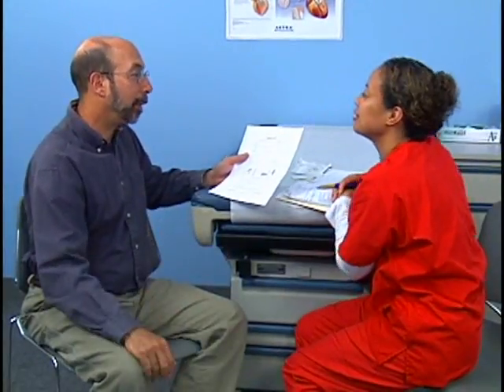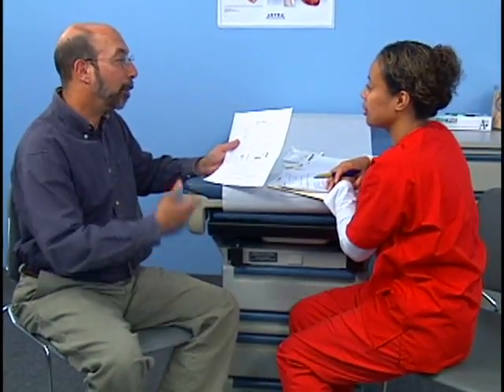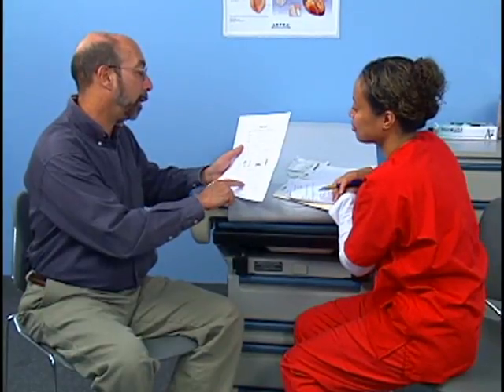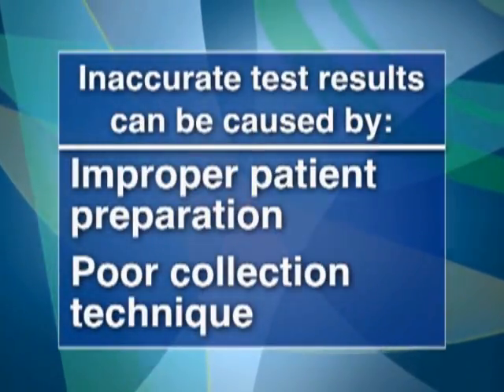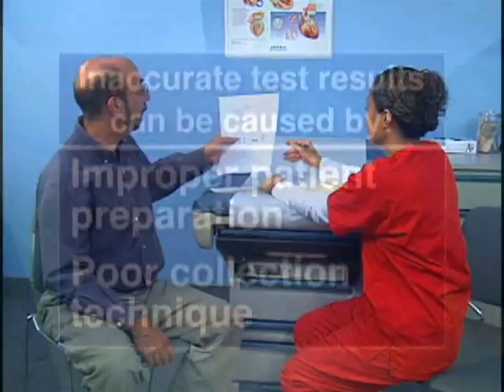Give the patient an opportunity to ask questions. Ensure that the patient understands the instructions for preparation and collection of the stool specimen and for storage of the slides. Improper preparation and poor collection techniques can lead to inaccurate test results.